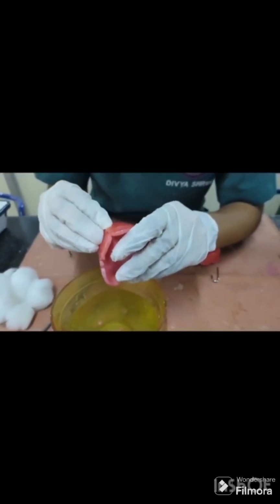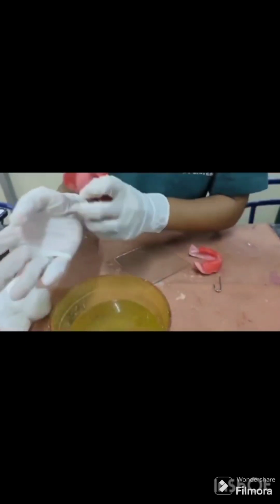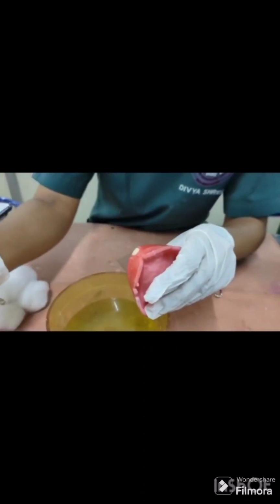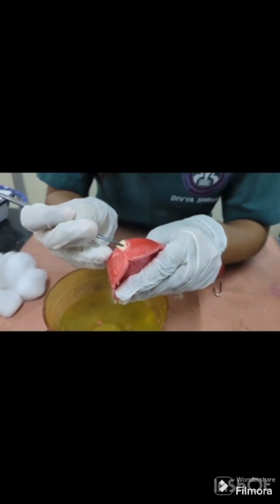The maxillary tooth slopes labially about 15 degrees when viewed from the side. The 15-degree angulation is more pronounced in the incisal half of the central incisor, and the cervical margin should be within the occlusal rim. The position of the central incisor when viewed lingually is not straight but follows the arch form.